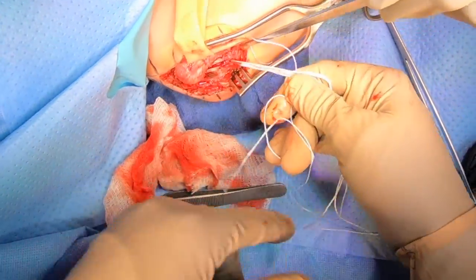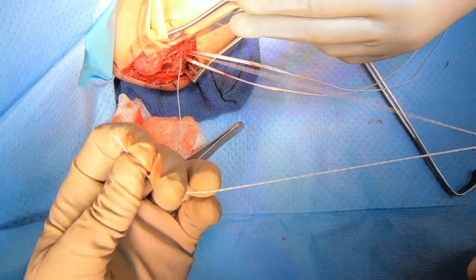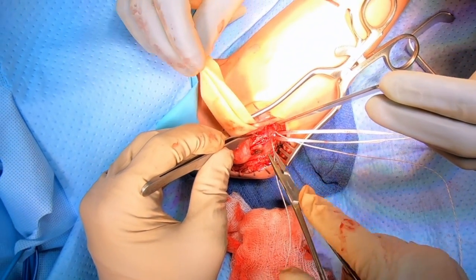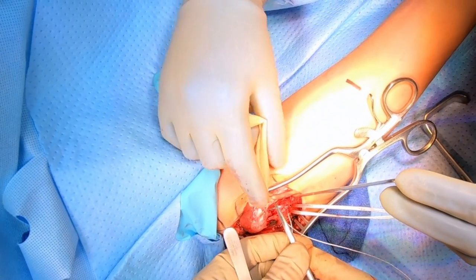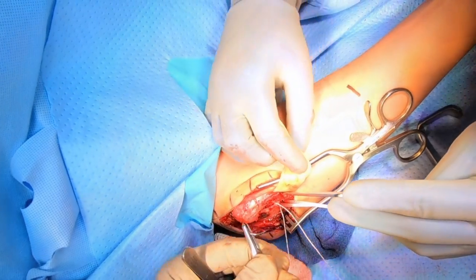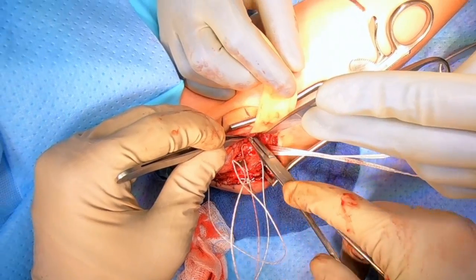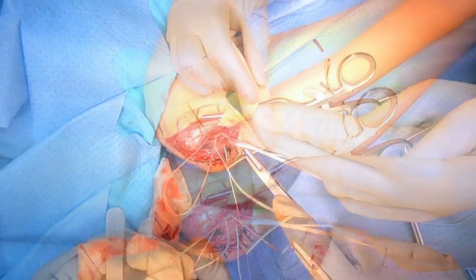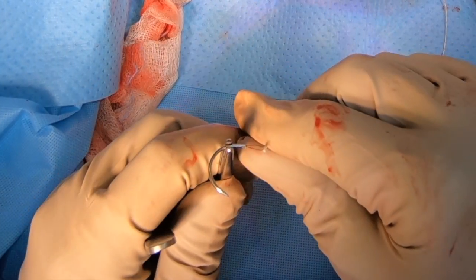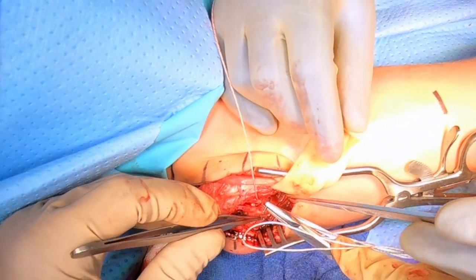You'll see me separating the sutures, loading those onto a needle, and then passing that needle through the ligament tissue that is torn. We'll pass that once and then again, and on the second pass we'll pass the needle back through the loop created by that second pass. That is what's called a locking stitch — it makes sure that the suture grabs hold of the ligament tissue to ensure an excellent grab on that tissue so that it can pull it right back to the bone from which it is torn.